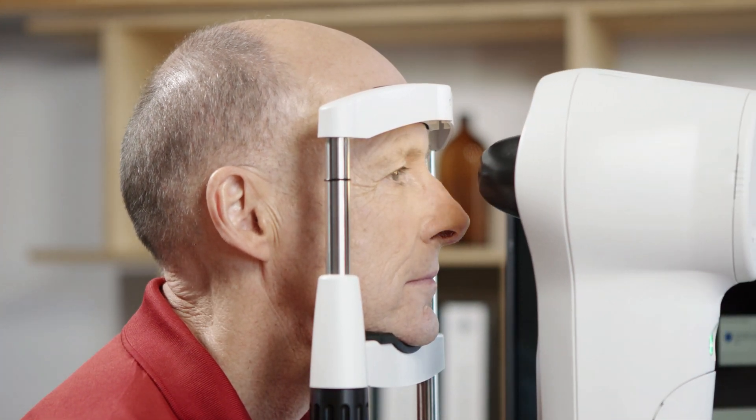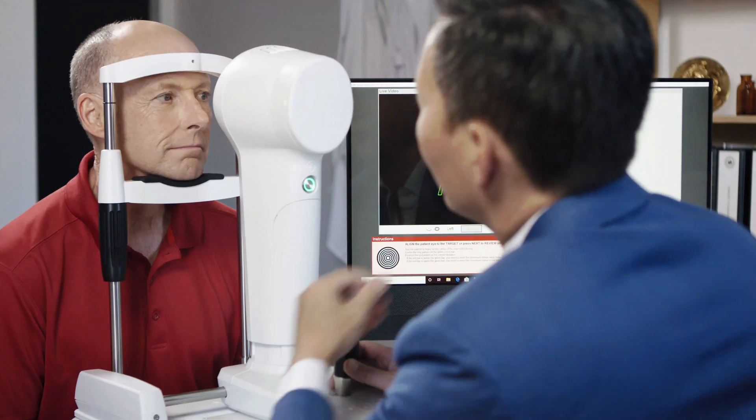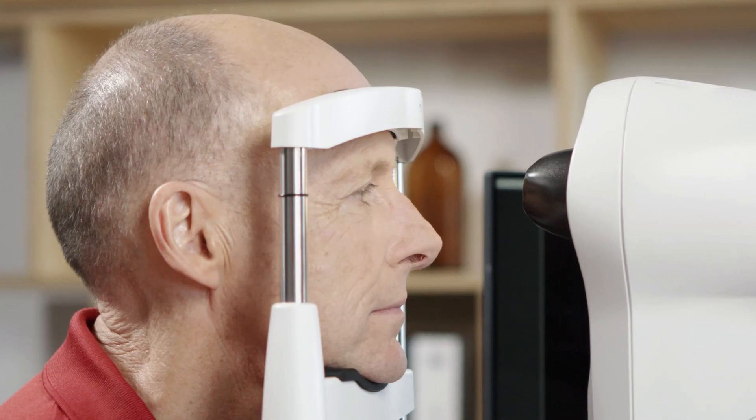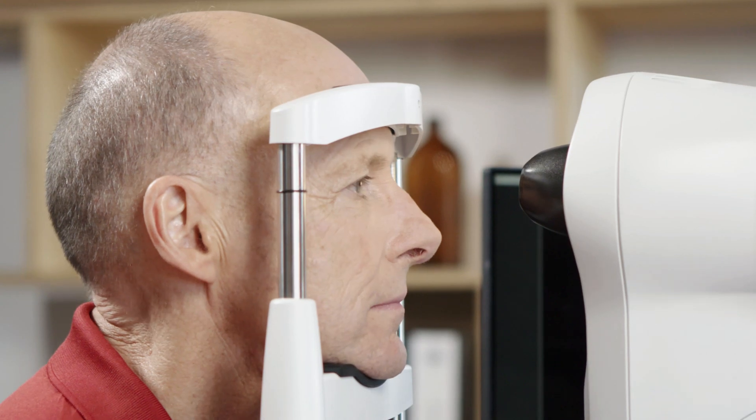To stop the brow from coming in contact with the cone, have the patient protrude their chin forward onto the chin rest while still maintaining contact with their forehead on the forehead rest.